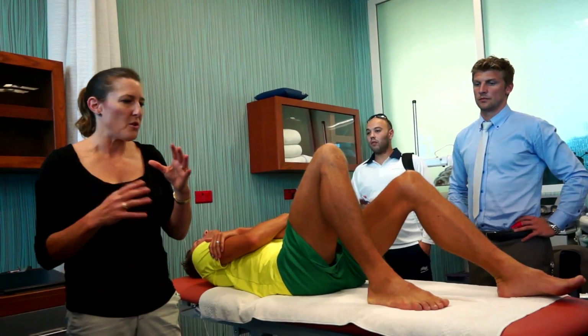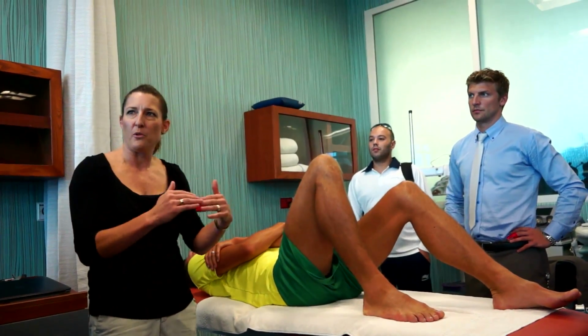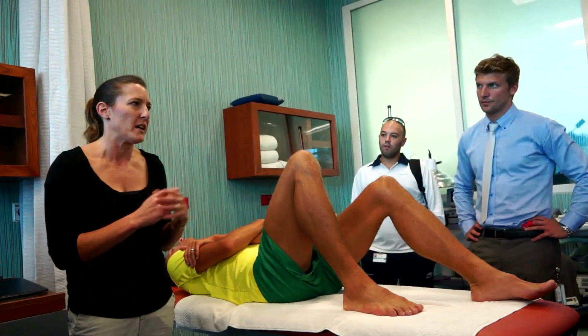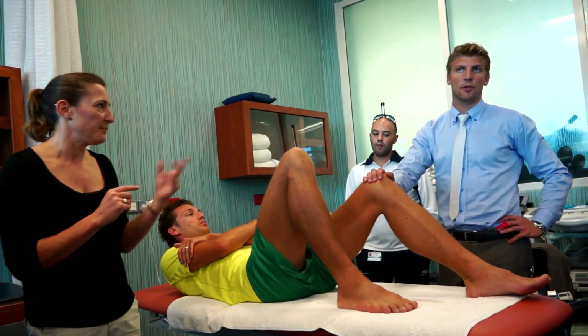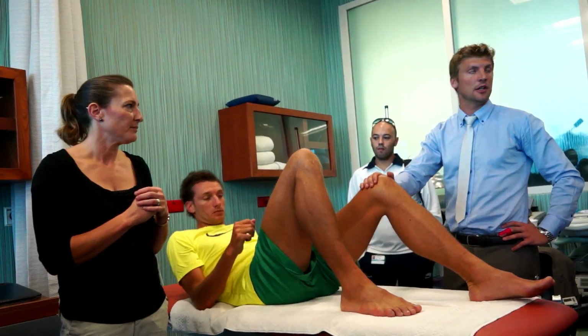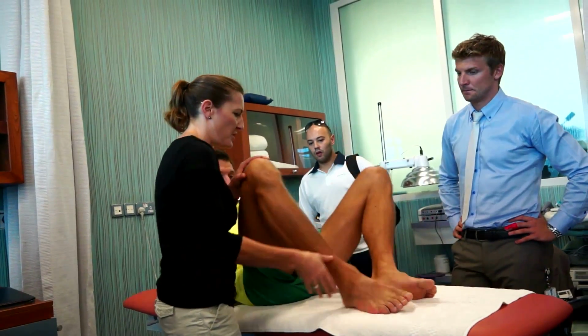So if you're loading an athlete and then wanting to see if they've coped with that loading before increasing the loading again, this test is one of the things that's used along with some of the other pain provocation tests. This is also one of the reasons why we're using it for the acute injuries. When they get in here, we'll follow them regularly and measure their... Just one comment about using the dynamometer, so I stay in that same position.